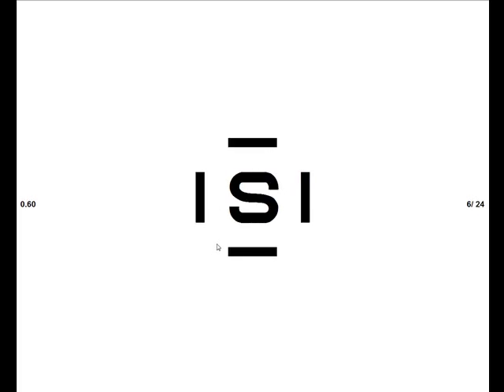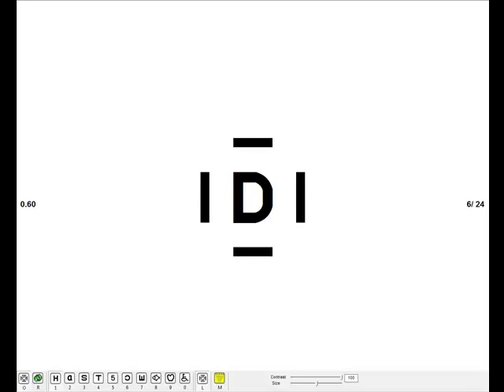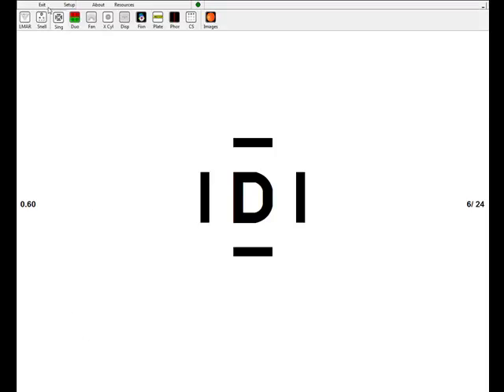Single letters, much the same. A single letter is shown, you can have all the different optotypes. You can turn the crowding bars on and off by clicking on L at the bottom of the screen or pressing L on the keyboard. All the other options that I've showed you for the logMAR chart also apply for the single letter chart.